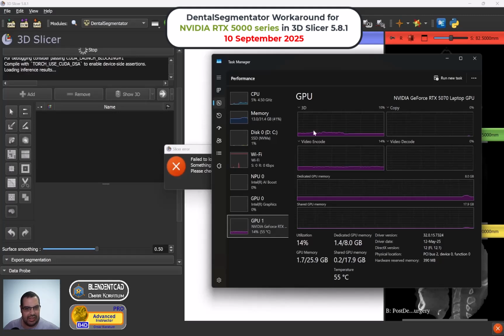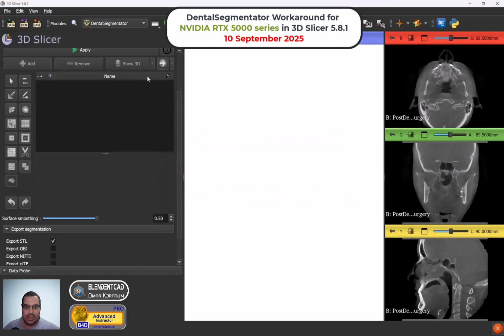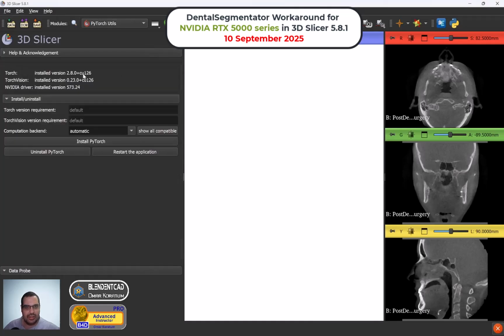And now, as you can see in the background, the segmentation has failed. The reason for this is because the PyTorch in 3D Slicer 5.8 is still not compatible with the latest RTX 5000 series. So what we are going to do, we are going to search for the PyTorch utilities, as you can see here. And here is the latest version for 3D Slicer, which is CU 126.